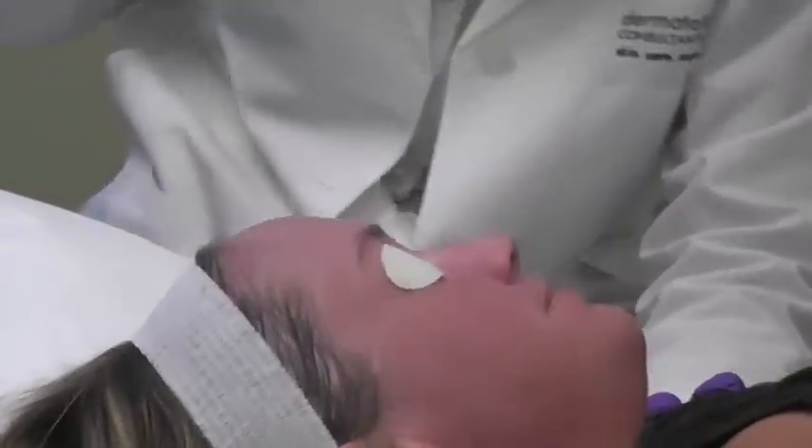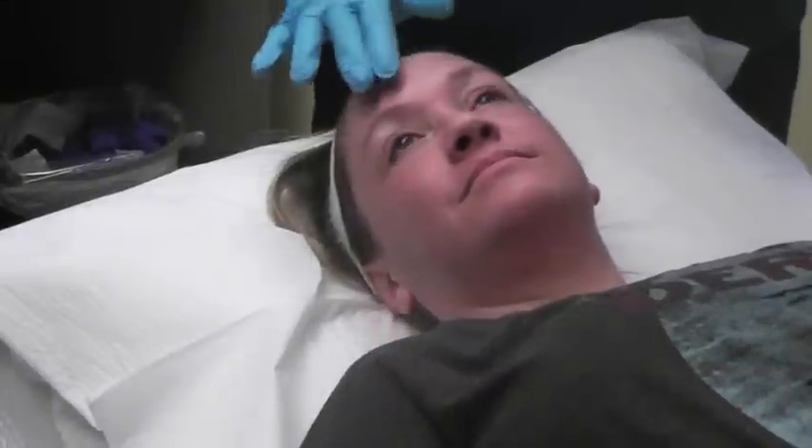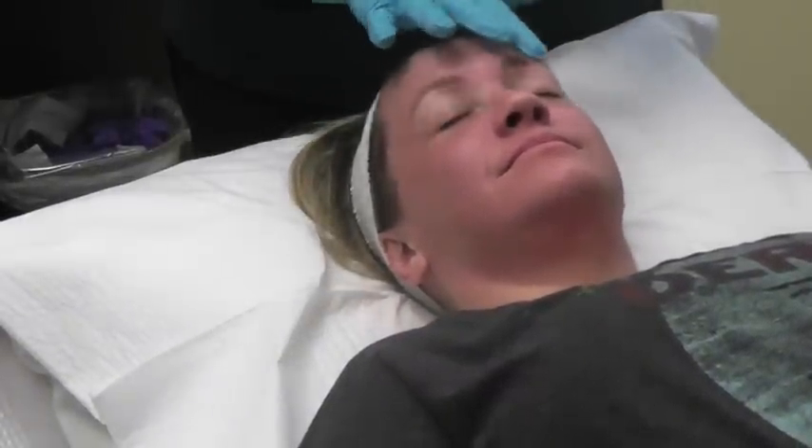You are done — you did great. Now Brooke is going to go ahead and get just a lot of ointment on the skin, and that's going to make it feel really, really nice.